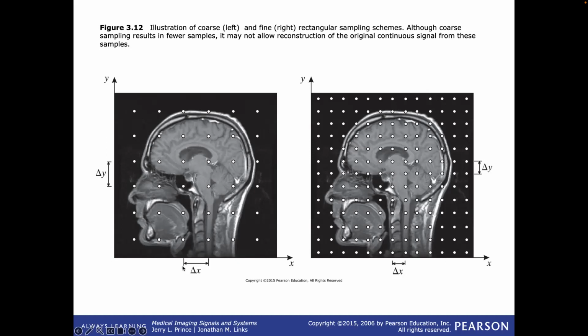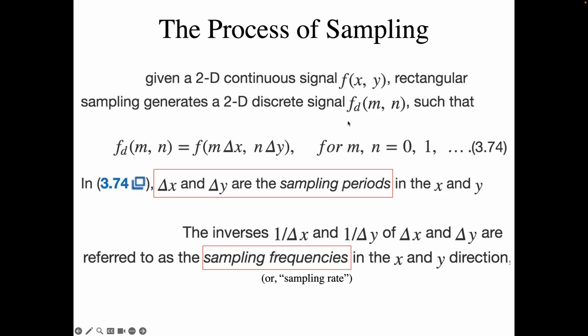So let's look at sampling frequency just for the mathematics of this whole thing. Those of you who watched Dr. Liu's primer, he's talked about some of this, so it's a good combination with this lecture. So we have a delta X, or a distance between sample points here, and this grid of these samples, we can call basically a two-dimensional comb function or a two-dimensional sampling grid. Obviously, the samples are far too far apart here to be of any use to us at this point, other than there's an object there or not. If you increase the sampling rate by a factor of 2, so delta X between the sampling points goes down by a factor of 2, then we see these samples.